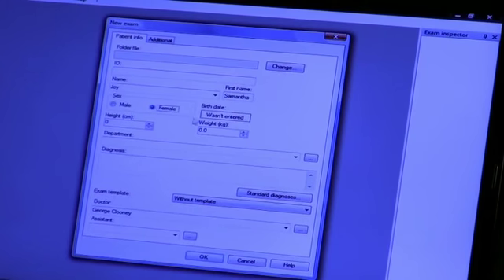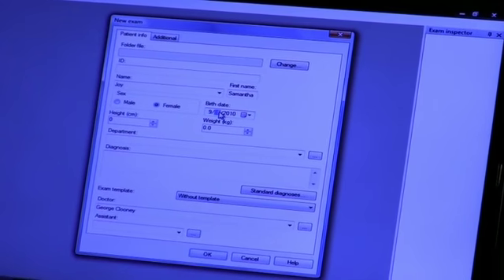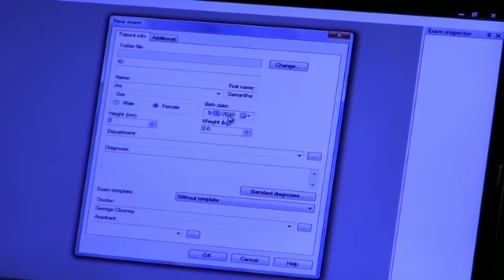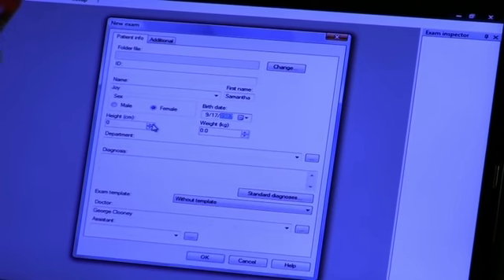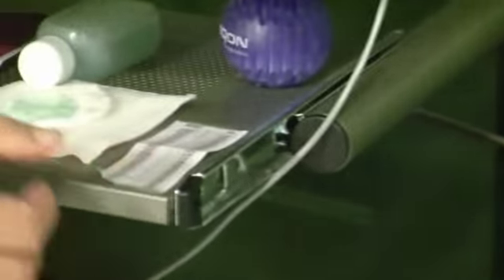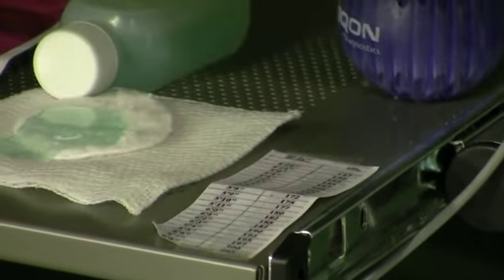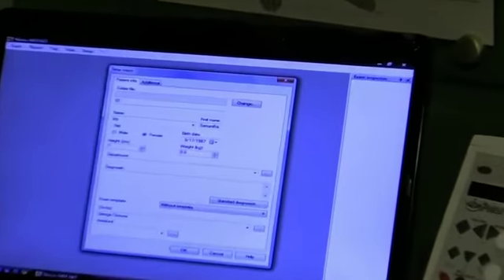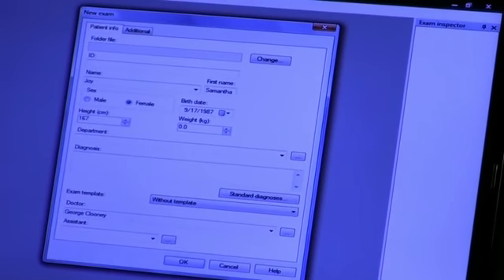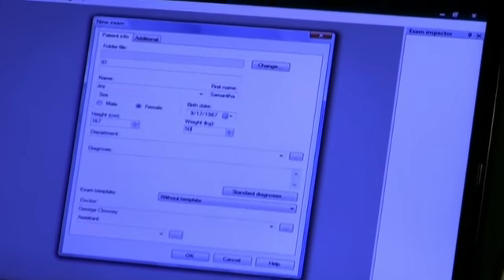And she's a female. And what's your date of birth? 9/17/1987. Okay. And about how tall are you? 5'3". 5'3", and I have this table here that tells me that 5'3" is 160 centimeters. It's important because in this day and age, everything is in centimeters, so you really have to have a table handy. And then weight, you already told me it's about 50 kilos.